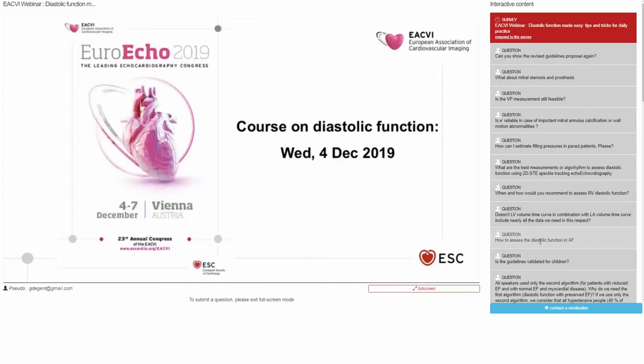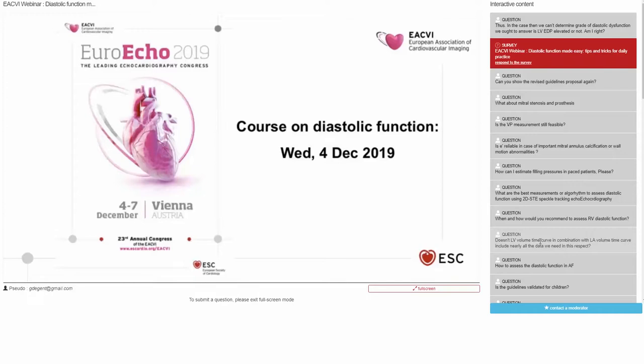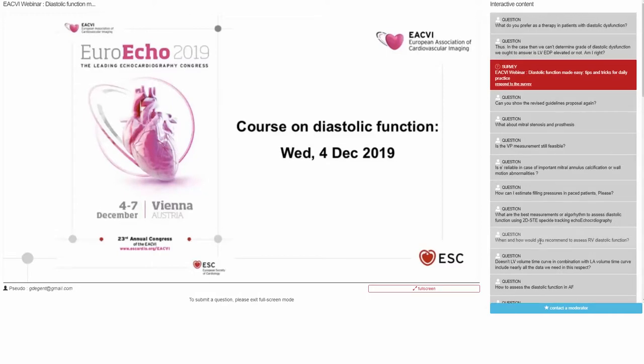Now, what about the diastolic stress test? One more question here. When you have reached peak exercise and you measure the post-exercise recovery period, is the TR velocity or the mitral E/e' the most useful measure to focus on? It's a short time, 1 to 2 or 3 minutes. I guess it's difficult to categorize which is more important. We look for both. Both, yeah. I couldn't say which is better. I think E/e', if it's more than 15, is pretty specific by itself. But if it's less than 15, then I think it'll be more specific combined with the TR velocity. So it really depends.